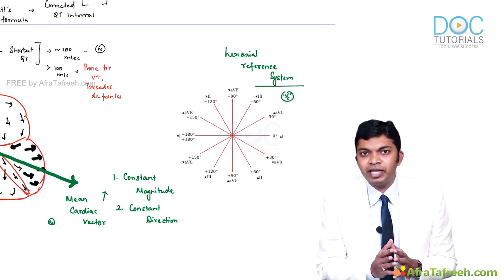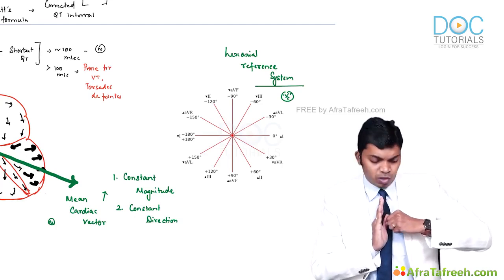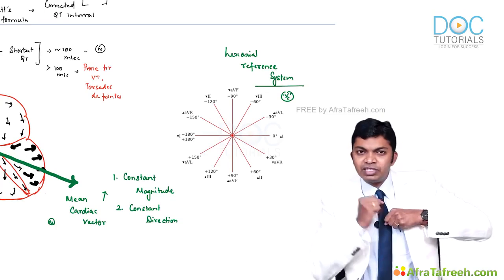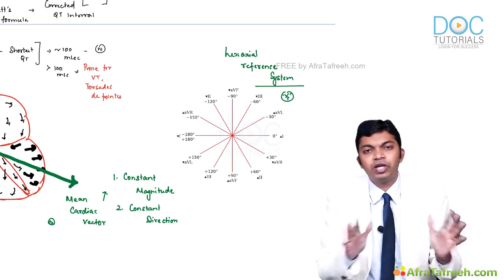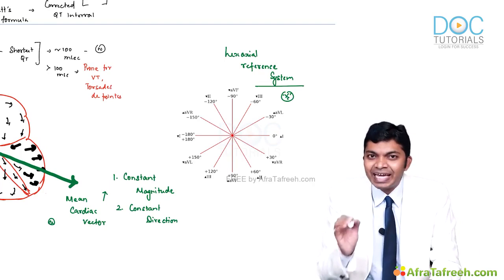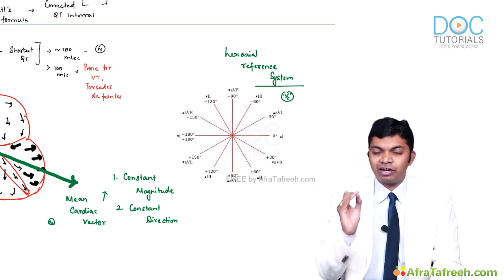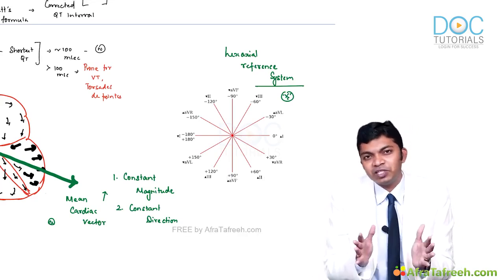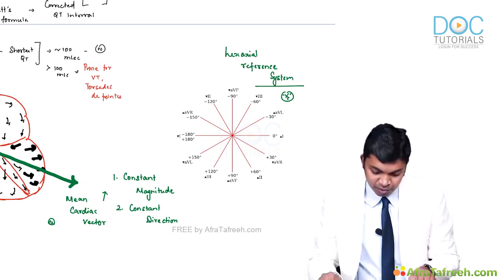You ask them what is the normal cardiac axis, they will say plus 59 degrees, and why, they say this is the midline of the body, the heart is slightly on the left side and is oriented towards the left foot, so the angle the heart forms with the midline looks like plus 59 degrees. No, doctors, it is absolutely wrong. Whenever we speak about axis, we are referring to the direction in which current is travelling, that's it. We are not referring to the anatomical location of the heart with respect to the body's midline.